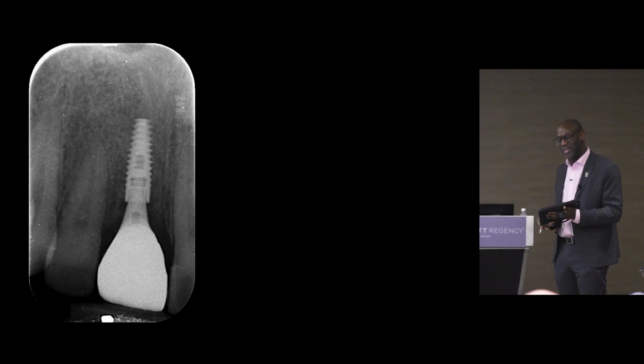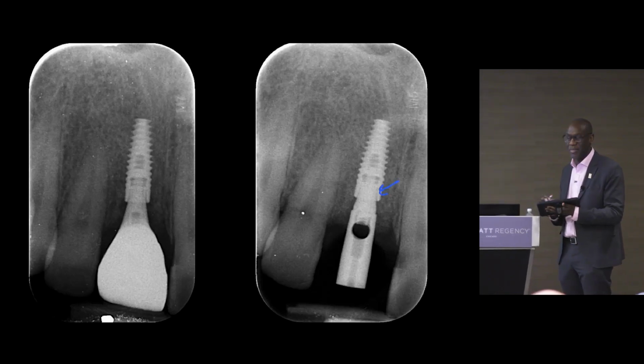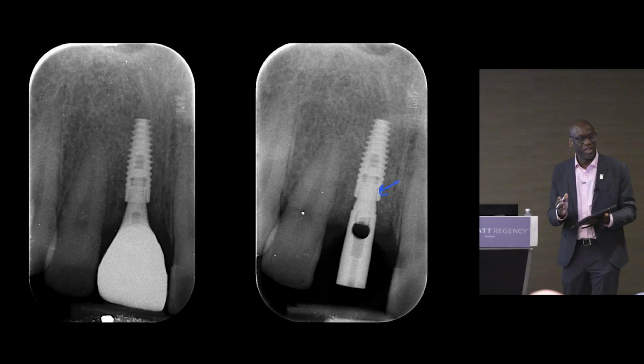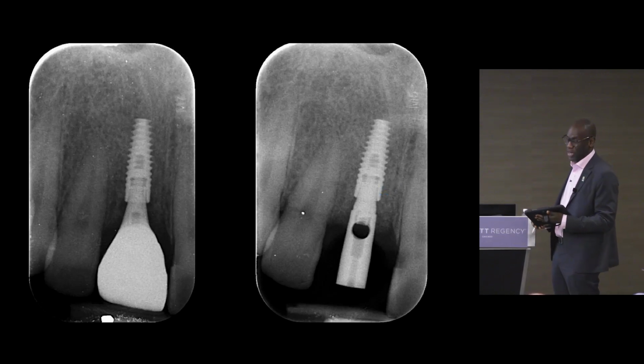And I said to him, did you take an X-ray with the scan body in place? He says, yes, of course I did. And he took an X-ray with the scan body in place, and if you have a look, you can see the same gap there on the scan body as well as on the final crown. So it's a really expensive remake.